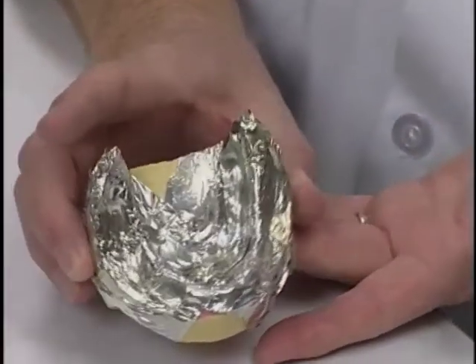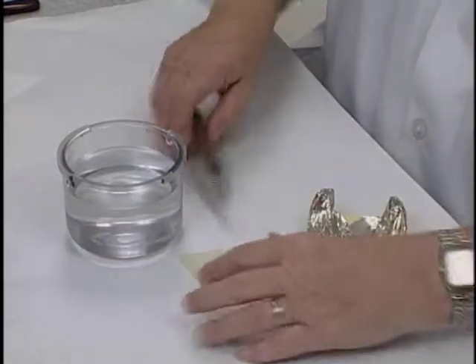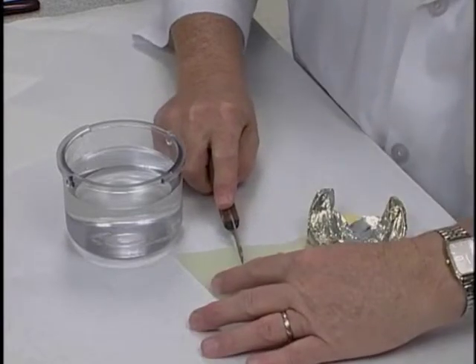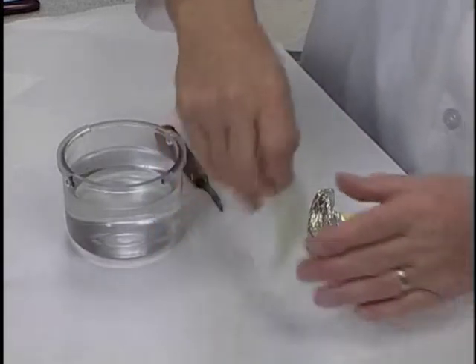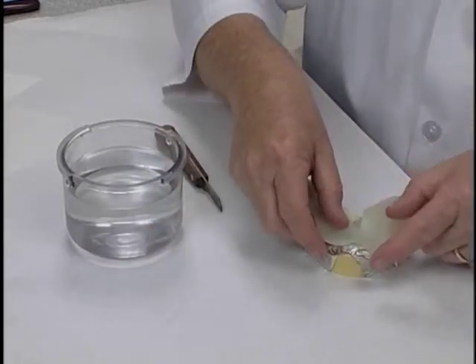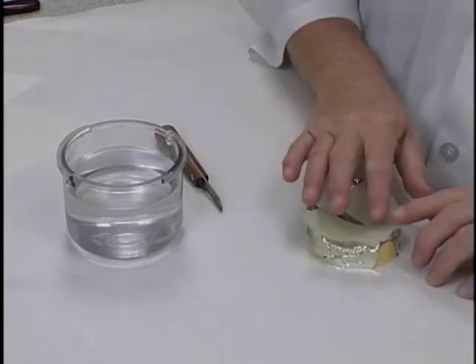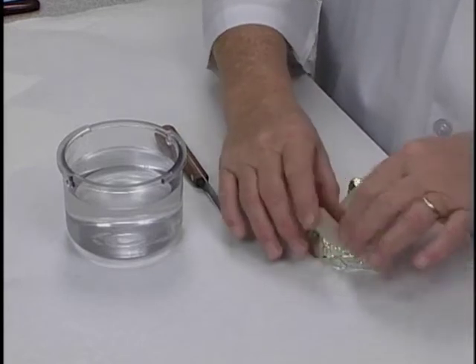Very convenient in working with a mandibular cast to cut the material right down the middle from about halfway back through the posterior part of it. This allows us to adapt the material much easier when we lay it onto the cast. And we'll bring it far enough forward to cover the labial portion to make sure it's covered properly.